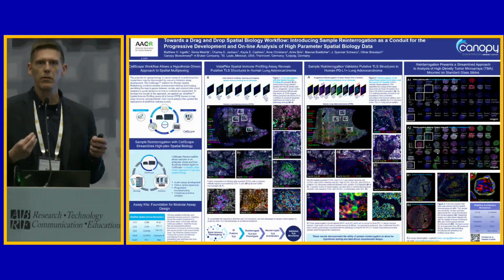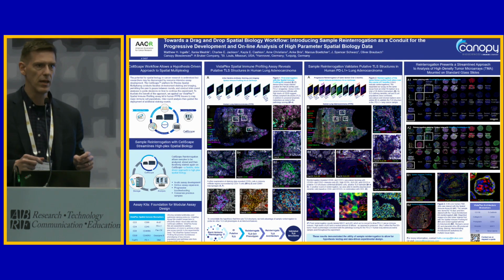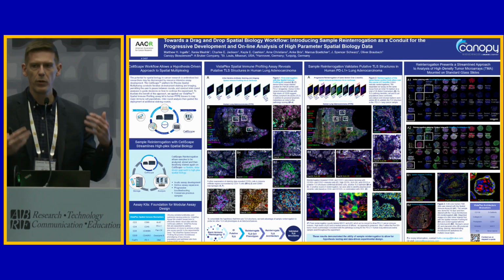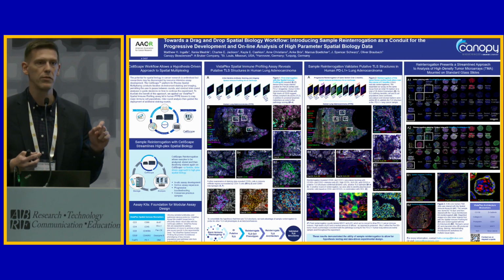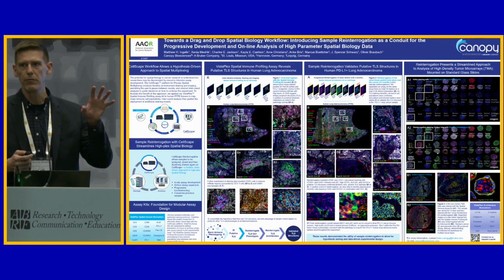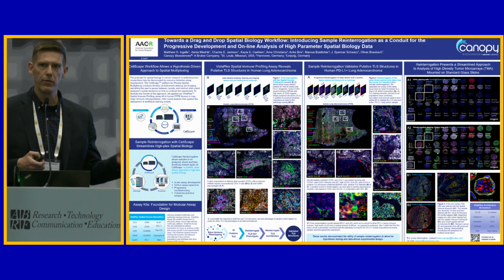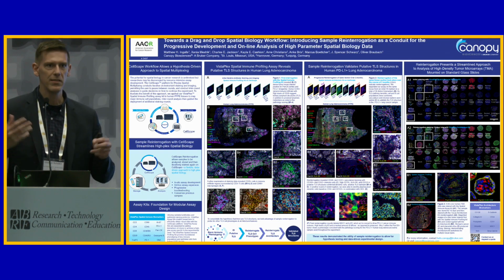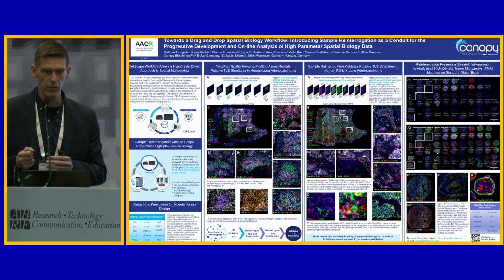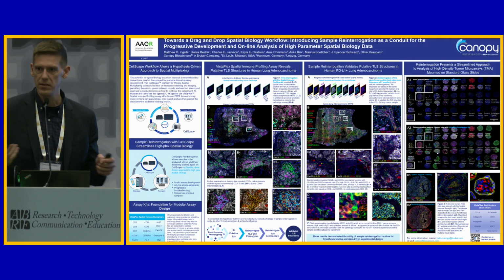There's another little caveat to the way we collect this data. This is multiplexed IF, cyclic multiplexed IF. Instead of putting all those antibodies on at once, we build these through sets of 5, cycles of 5. We stain for 5 antibodies, collect that imaging, and then perhaps put that sample in the fridge, bring it out a little later, and continue the cycle. What's key is that while it's in the fridge, you have the ability to take a deep breath and decide what markers you want to sample for next. This allows what we call hypothesis-driven assay development.